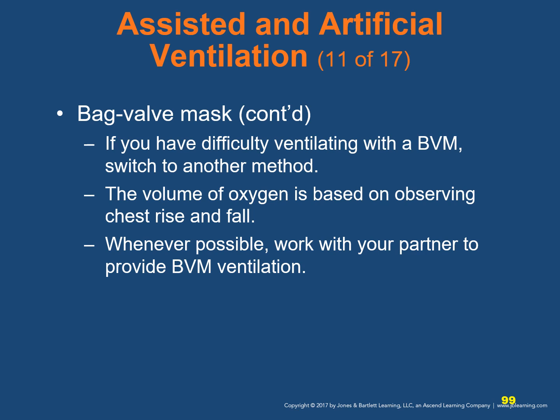In patients with ongoing CPR and an advanced airway in place, such as an endotracheal tube, a laryngeal mask airway, or a King airway, use simplified ventilation of 1 breath every 6 seconds without pausing chest compressions.